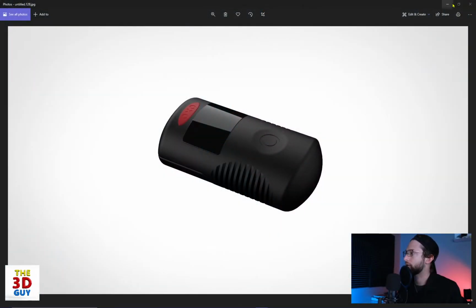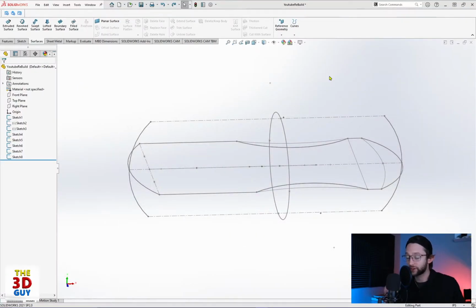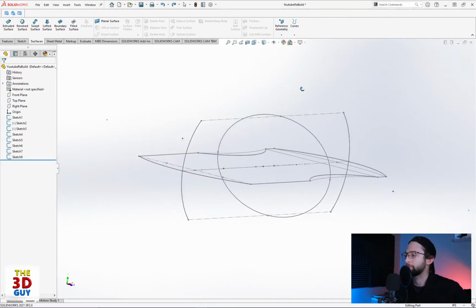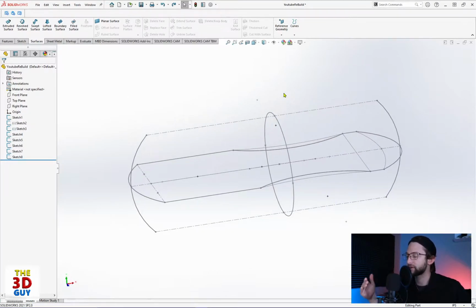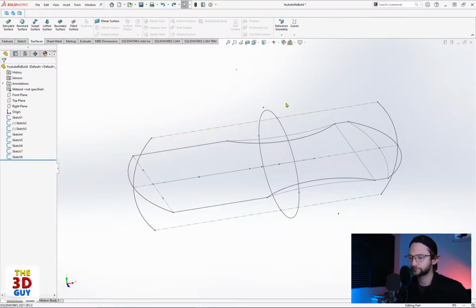So I'm going to close that down. And let's just start with SolidWorks. As I mentioned in the comparison video, I already had the sketches in place because I want to really showcase surfacing and the usability and the interface itself more than anything. So I have the first three views, the front, side, and top views already sketched out. And I've also isolated individual lines that I know I'm going to be needing in the future. Typically, I'd be doing these isolations later, but again, I'm just trying to speed through this process and to showcase specifically the surfacing.